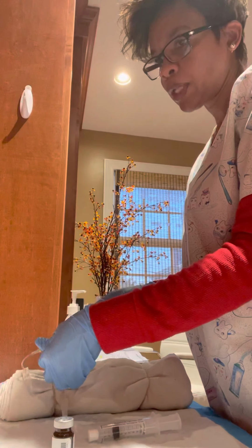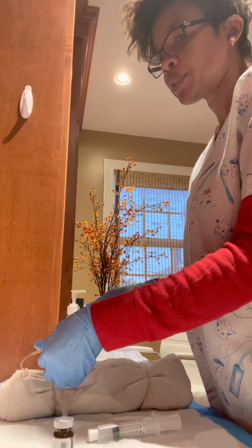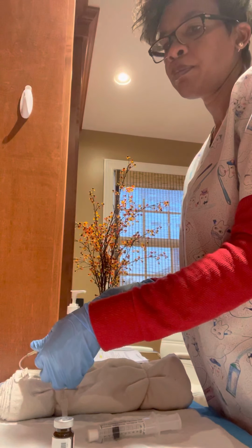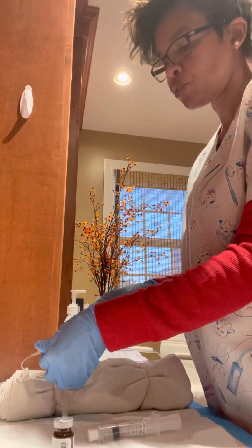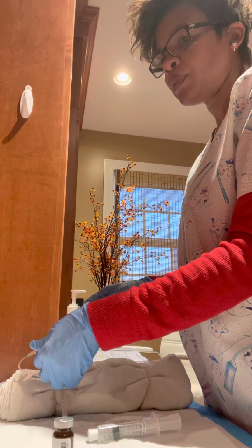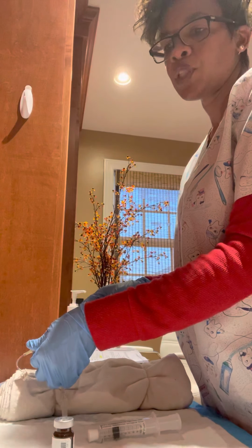So while I'm infusing slowly, this is the time that I would just talk to my patient, ask her how she's doing, how was her night, and about the weather, just any concerns that she may have.